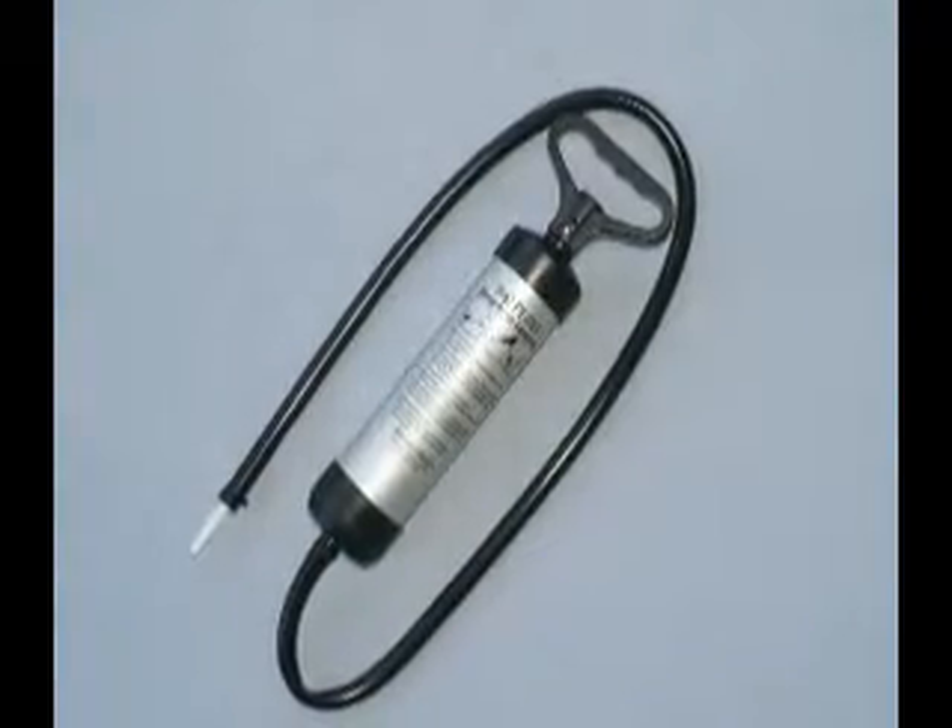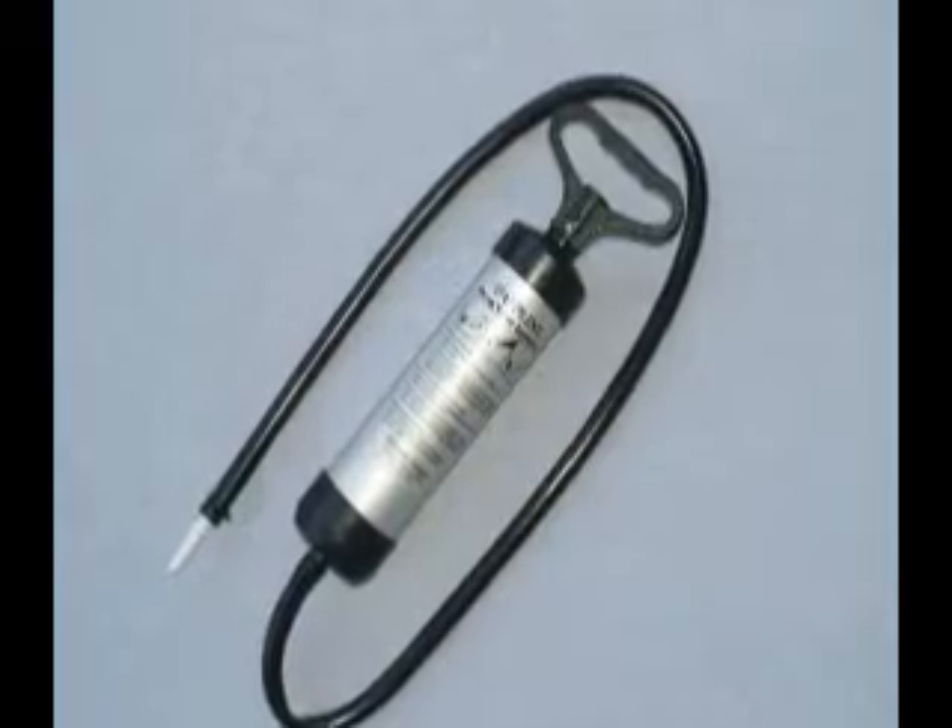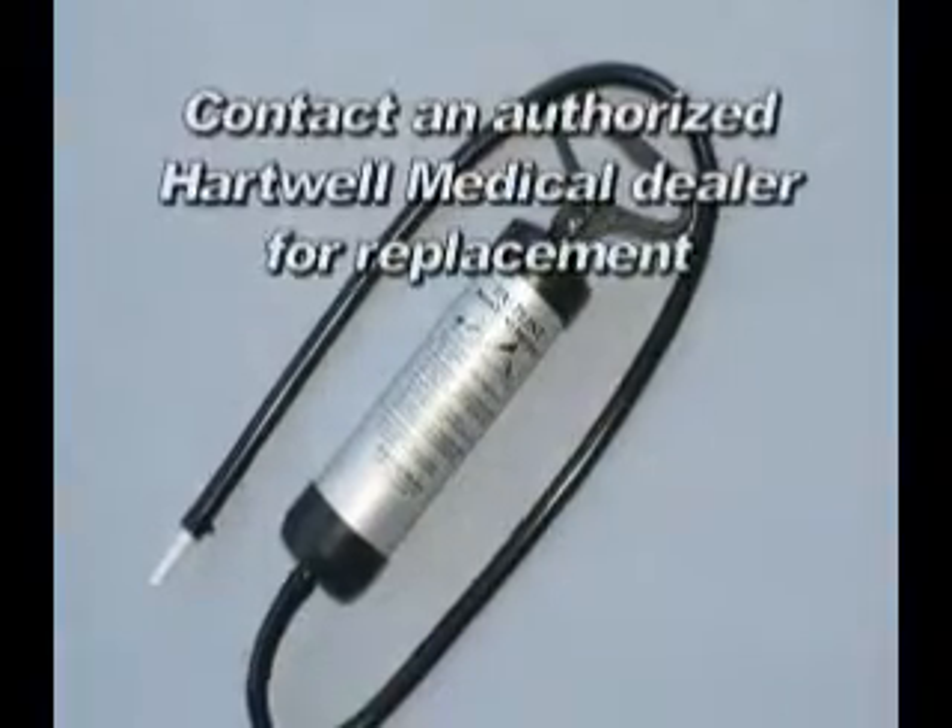The plastic pump does not require any maintenance. Contact your authorized dealer should you need a replacement.